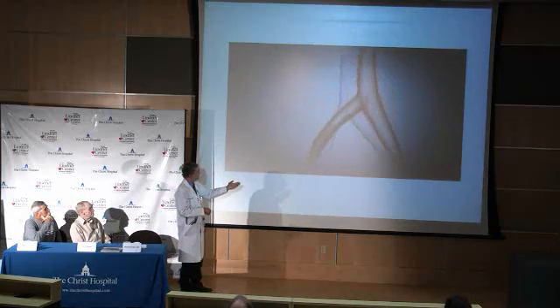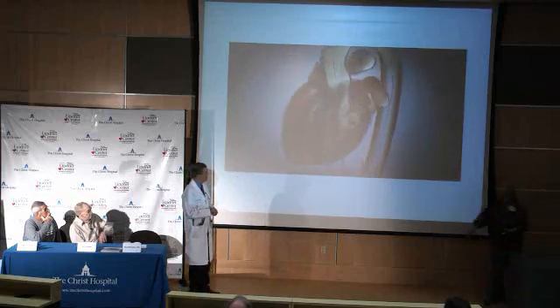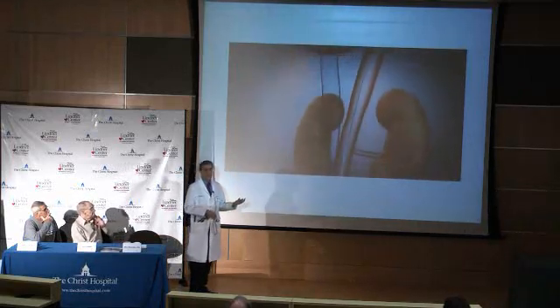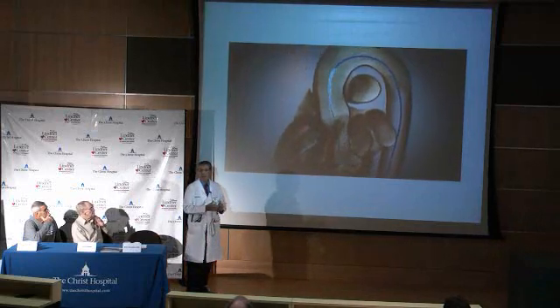We usually come in from the leg, from the femoral artery, and put a wire all the way up the aorta — this is retrograde — and place that wire across the aortic valve.